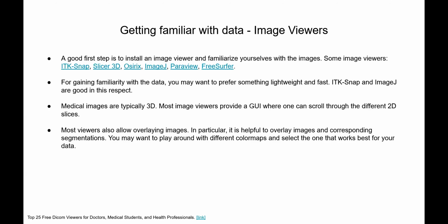The next thing is getting familiar with the data in terms of how it looks. There are a number of viewers, and I think if someone is new, it really helps to get a feel of the data by looking at it, scrolling through these 3D stacks of slices and so on. Also, if you're looking at segmentation, it's nice to overlay images and segmentations and play around with the color maps, just to know what kind of data you're dealing with, what the intensity ranges are, and if there are some patterns.